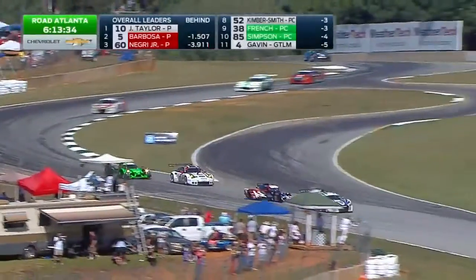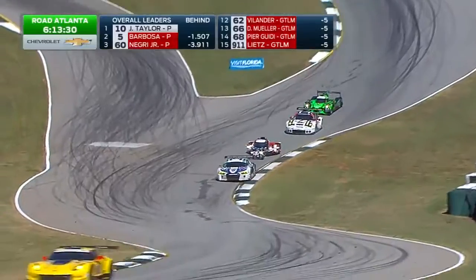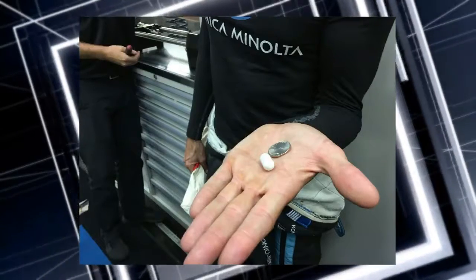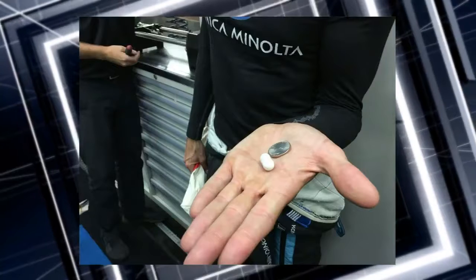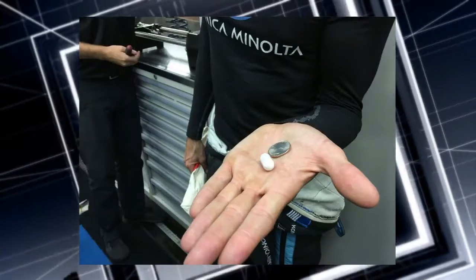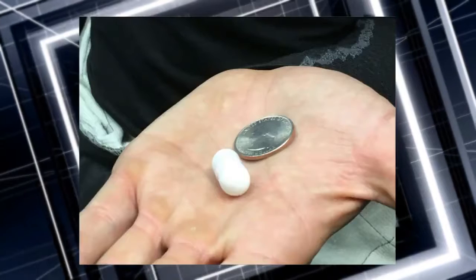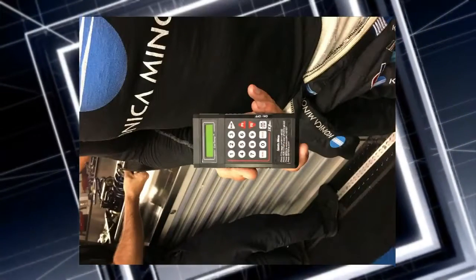Besides chasing success today here on the racetrack, Wayne Taylor Racing's driver lineup is performing several tests in driver science. Like out of a movie, each driver swallowed a transponder pill today that lasts 48 hours in the body. It transmits heart rate and true core body temperature into a small data recorder inside the race car. The goal, to one day use the data in real time, allowing pit box computers to compare lap times with signs of driver fatigue.